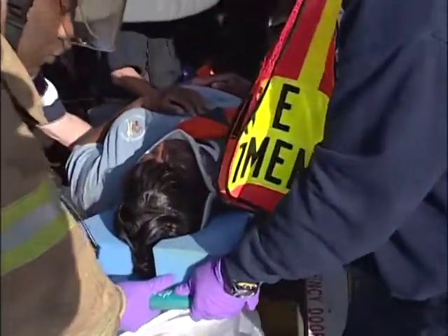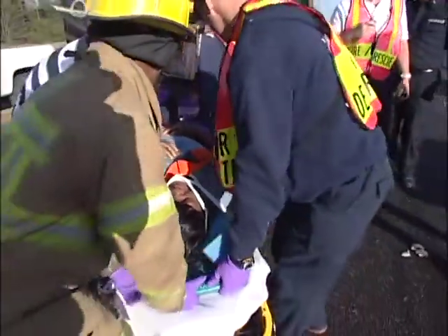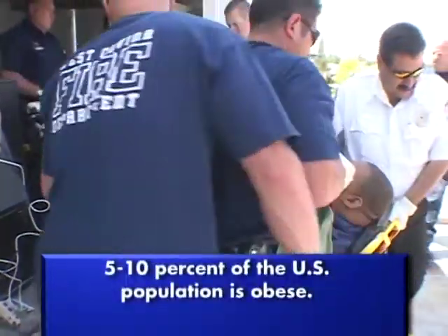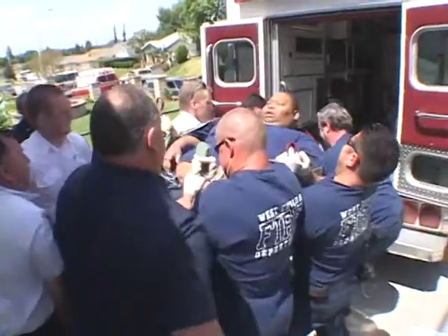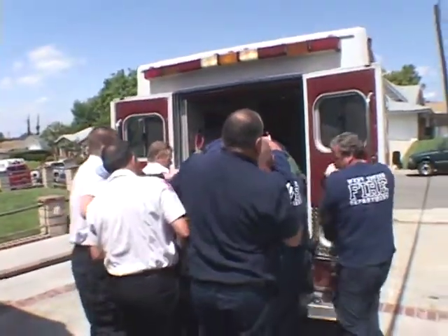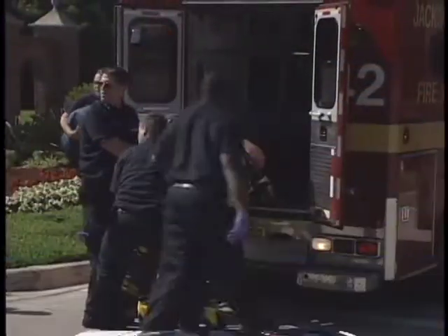Certain patient conditions such as spinal injury, head injury, or pregnancy call for special lifting and moving techniques. Also, special consideration and equipment may be needed when moving bariatric or large patients to prevent injury to yourself and the patient. Most gurneys are rated to handle up to 500 pounds. However, when raised to their full height with extremely heavy patients, some can be unstable.